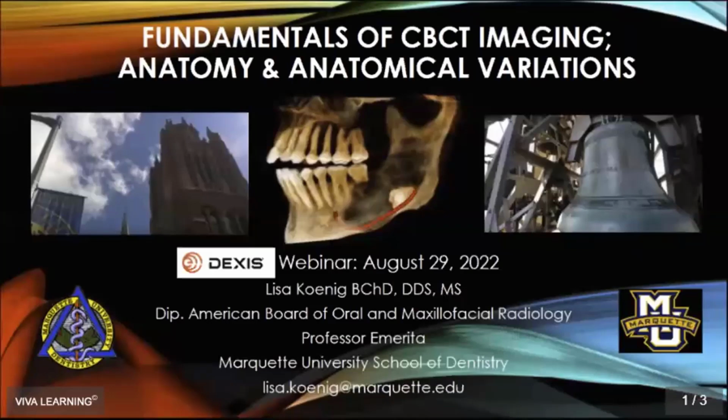I've had a couple of instances where patients have been referred because they have symptoms, they have a tingling sensation, and then we do a CBCT, and that's frequently when we see the implant has been placed too far lingually.